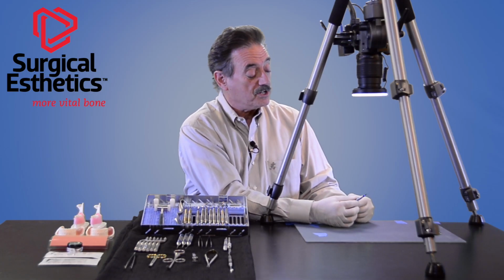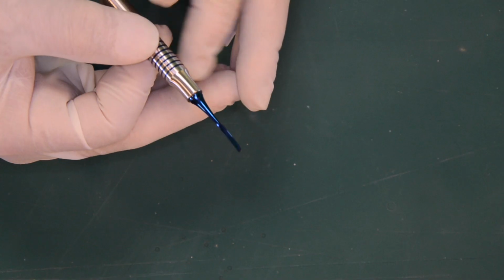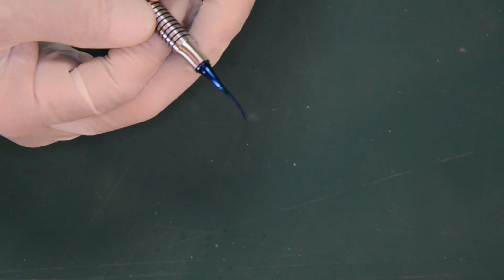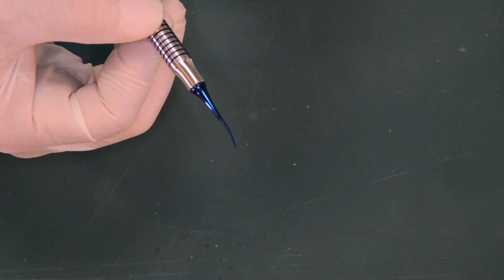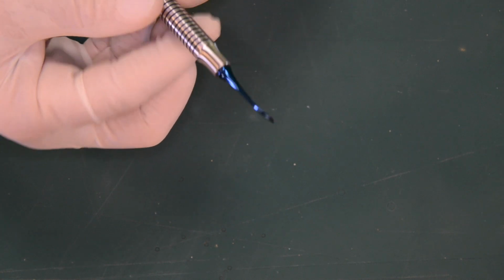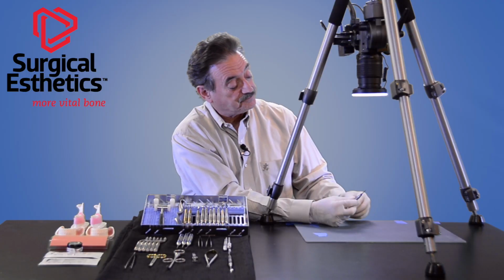This is great for when you're raising a papilla. One of the things we don't like to do is put an elevator in when you're extracting a tooth and smash the papilla, so that using a microperiosteal elevator, you're able to get between the teeth and gently raise that papilla out of the way. You can't do that with a typical traditional periosteal elevator because it's too thick and too fat.